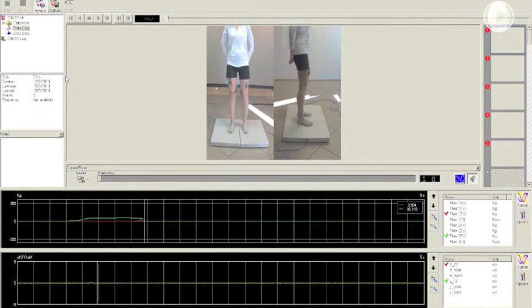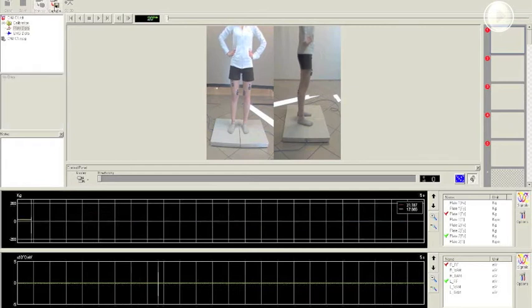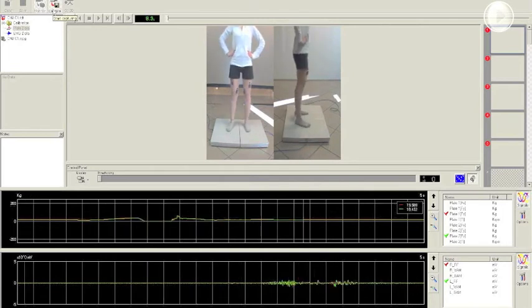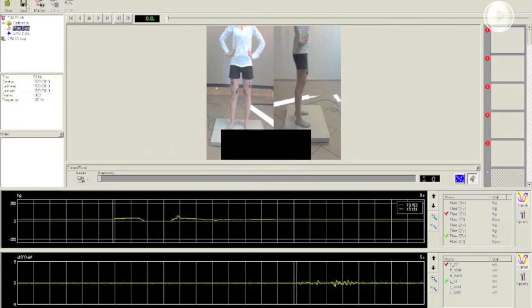We start with a counter movement jump, so I will click on capture, we will wait a few seconds, and then we will make the real jump. Okay, jump. Let's wait while we get to a stable condition and stop the acquisition. Here we have the download of the data of the EMG, and we click on save.